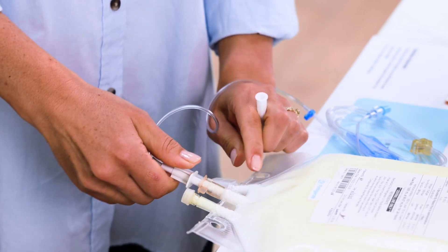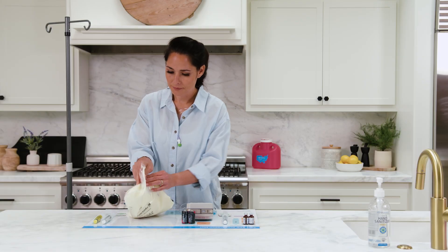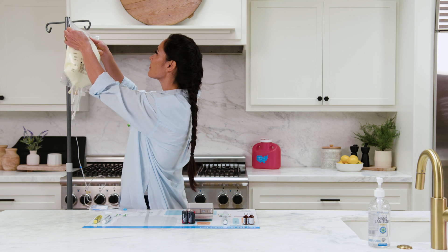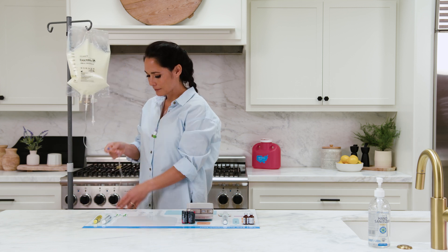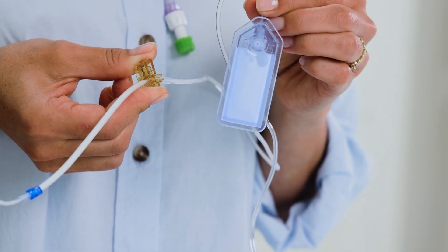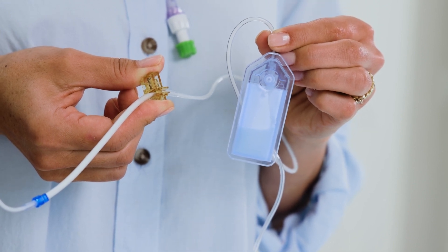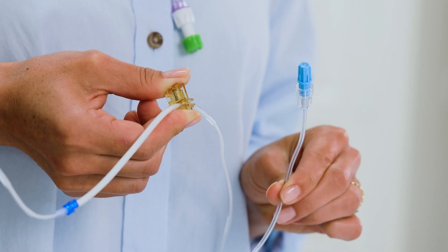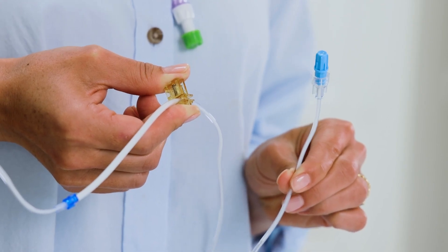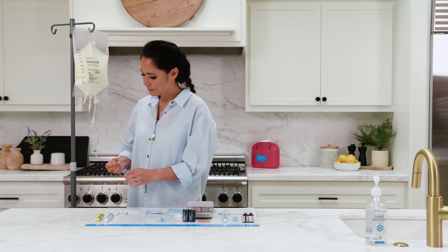We will show you two ways to prime your tubing. The first way is to prime manually. Place the bag on the TPN pole, letting the IV tubing hang below the bag. Remove the cap from the other end of the IV tubing. Hold the filter so that the flow is downward — this will allow the fluid to fill the filter properly. Squeeze the yellow stop-flow tab lever to let the fluid flow through the tubing until you see a few drops come out the other end. Make sure there are no air bubbles trapped in the tubing before continuing.